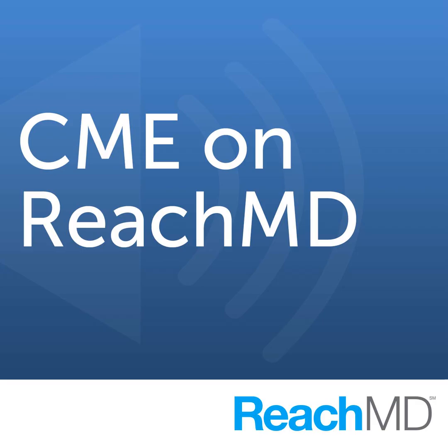And I want to add one aspect. Are we sure that we understand fully the LVOT obstruction? I don't know, and I don't believe it. Because we put forward a work saying there are at least 3 different pattern forms of LVOT obstruction. And if that makes a difference, that has to be clarified. It was built in a phantom. And let's see, I can only convince you, if you have large groups, go into that. It's not only about that gradient, it's also about the anatomy behind.